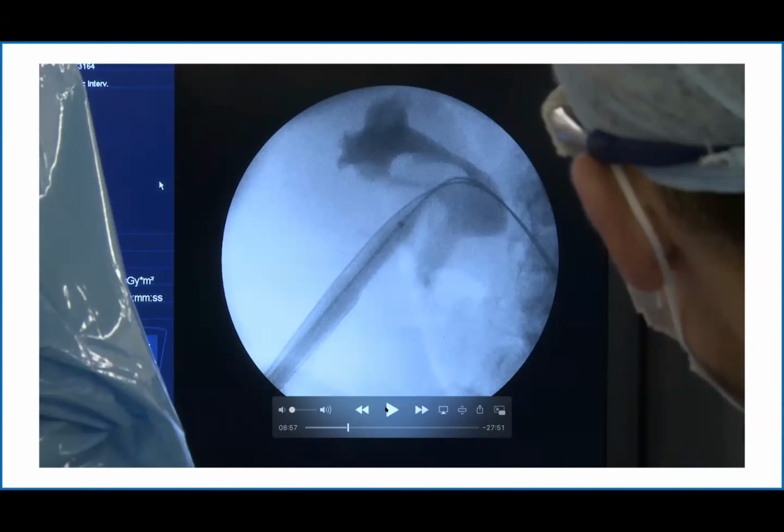And then there's a question on the positioning, which I'm not sure you covered between you, about prone or supine: what you've done in this case, and what you normally do. Generally speaking, this particular case was a supine, modified supine position, and certainly in my experience we have moved away from prone PCNL, and if we can do it supine, we tend to favor supine positioning for a variety of reasons, particularly in this case where we were planning a combined case. It would have been much easier to perform the procedure in a supine position, notwithstanding the benefits in terms of the anesthetic, and in terms of the timing and positioning of the patient, saving time with supine rather than prone. Yeah, right. So in which sort of cases would you go for a prone approach?